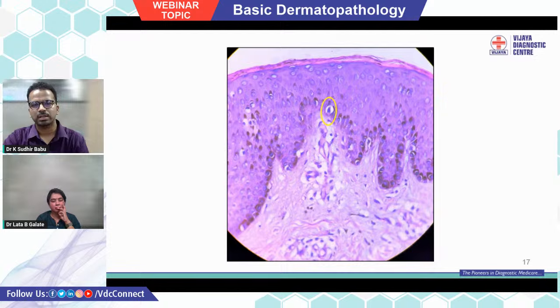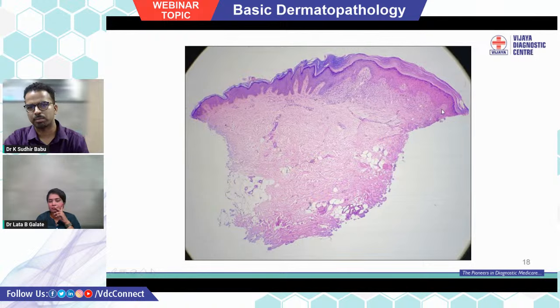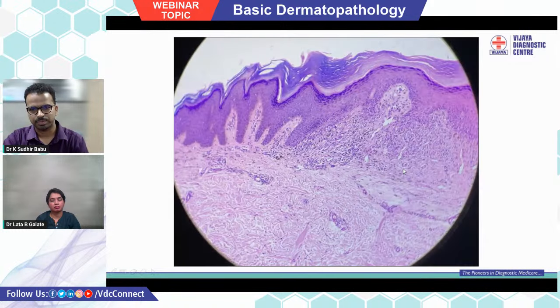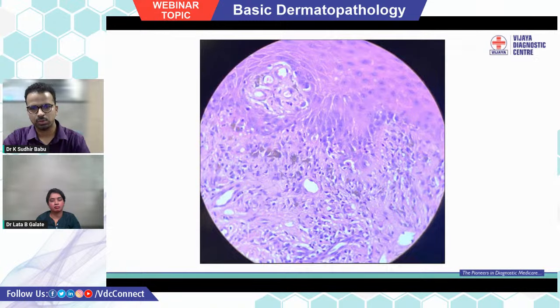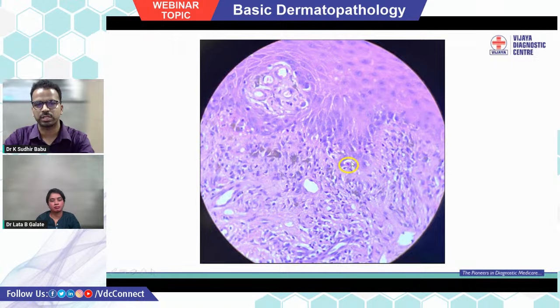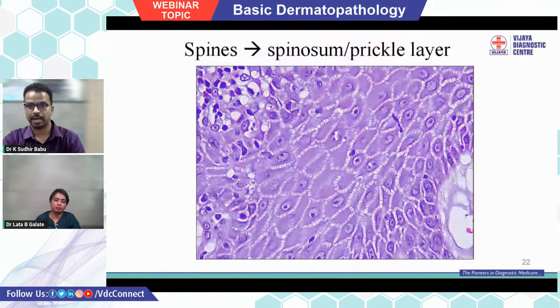The most important thing to assess in the basal layer is whether it is preserved or not. On the left you can see the basal layer properly with a clear distinction between epidermis and dermis. On the right side, the basal layer is disturbed and blurred completely, with inflammatory cells present — this comes under lichenoid reaction pattern. You can also see necrotic keratinocytes. Notice the brown-colored melanin pigment within the dermis — this means the basal layer cells got damaged and melanin pigment came into the upper dermis. This is called pigment incontinence.